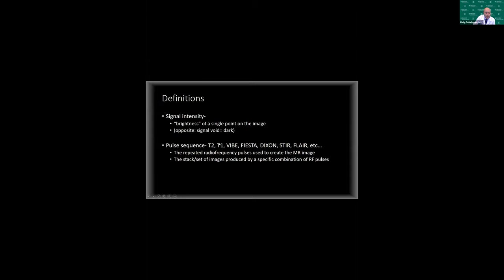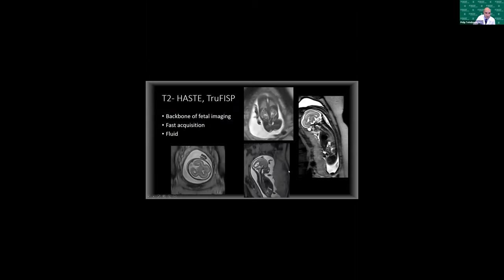There are hundreds of different pulse sequences. The T2 weighted image is a fluid-weighted image — the backbone of what we use in fetal imaging because it's very fast to acquire. On these beautiful axial images through the brain, you can see fluid in the frontal horns, the CSF, and even amniotic fluid between the fetal digits. On coronal views you can see CSF in the spine, T2 signal intensity in the lungs as the alveolar spaces develop and carry more amniotic fluid, urine in the collecting systems, the fetal globe, and the stomach bubble — all fluid-containing structures appearing bright.